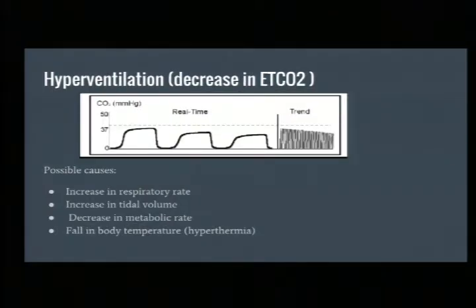If they're hyperventilating, so increasing your respiratory rate or an increase in your tidal volume, your anxiety patients, that's this increase in respiratory rate. They may not be taking in much. Sometimes they are. Other times they're just fast, and you can see their CO2 ticking down because they're blowing off so much, and then all of a sudden they get their carpal pedal spasms and they freak out more. So it's a nice reassuring way when they say, oh, I'm asthmatic, and you really think they're having an anxiety attack. That's a nice way to put that on and see that response on them. And then a sudden fall in their temperature, or gradual because you've induced, they were hyperthermic and you've cooled them off.